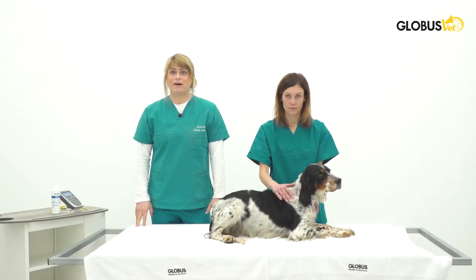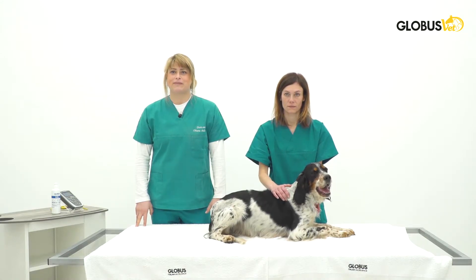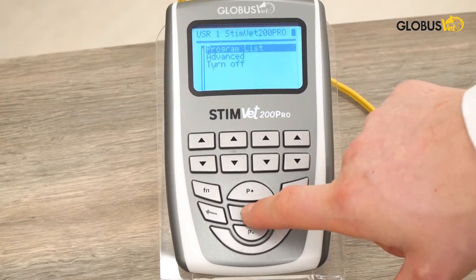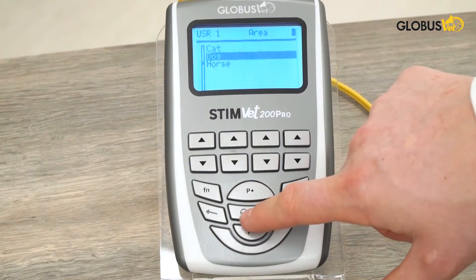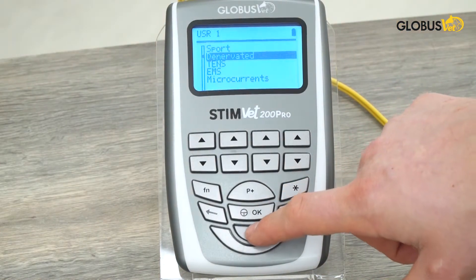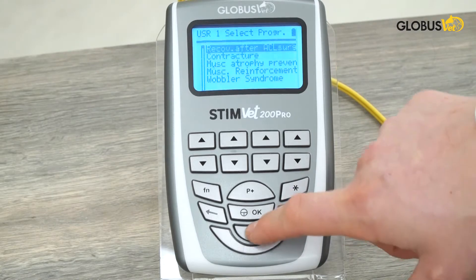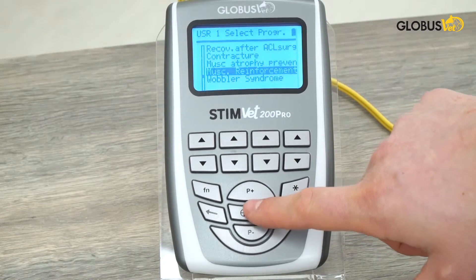Today we will talk about the ElectroStimulator, specifically the StimVet 200 Pro. Let's go over the program list to select for muscle atrophy treatment. We have the program list, we select dog, we go to EMS and we have the specific program for muscle reinforcement.